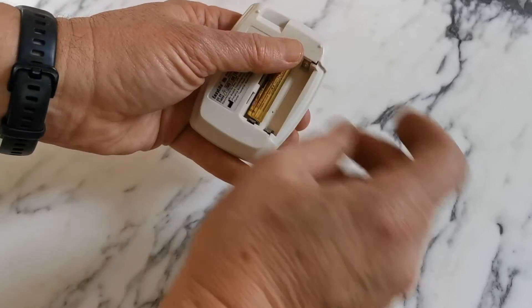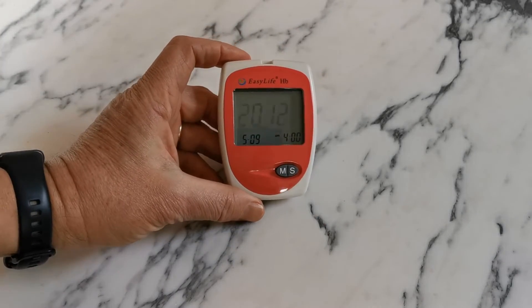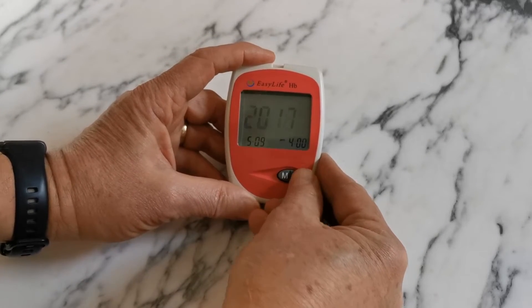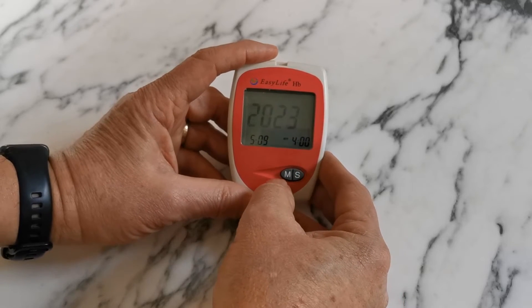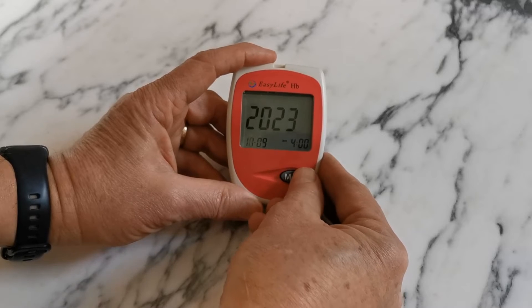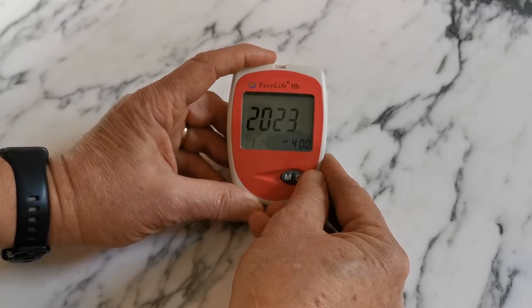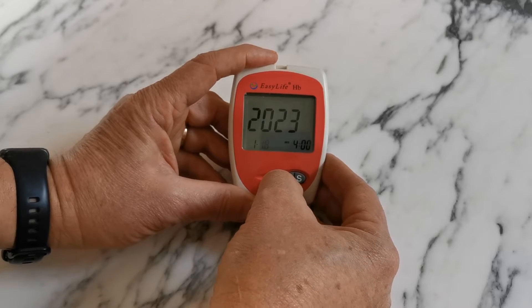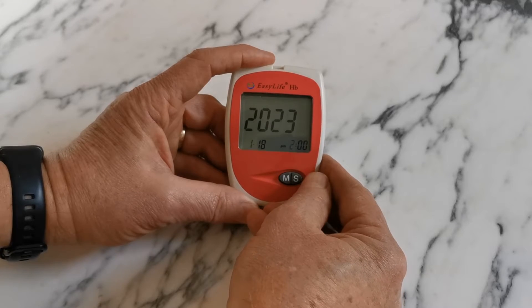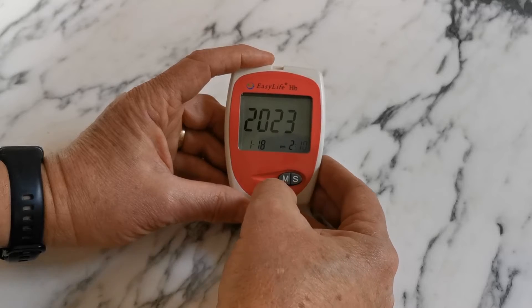Let's put the batteries in and start the setup. It's very simple — you just need to set the time and date. Insert both batteries following the direction guides in the base of the battery compartment, and you'll see it default to flashing on a year. Use the S button to increase to the current year, then press M to confirm. It will then default to the month — press M again for correct — then the day. We're on the 18th so I'll set that and press M. Then set the hour on the 24-hour clock using the S button, and the minutes, then press M.